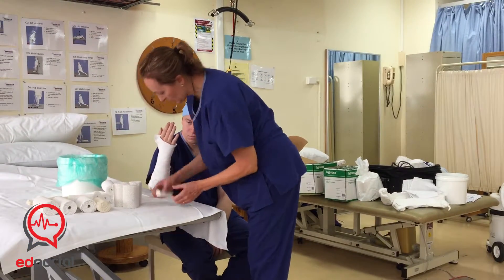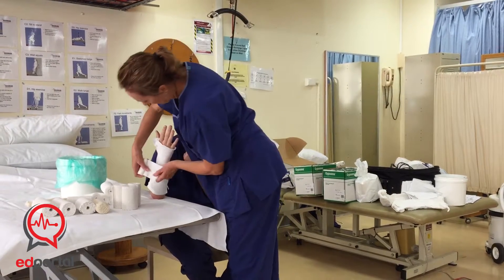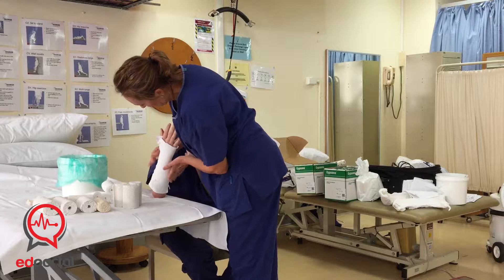You need enough coverage but not too much. If you've missed a patch, this is really user-friendly stuff — you can just grab a piece, tap it on, and pull it.